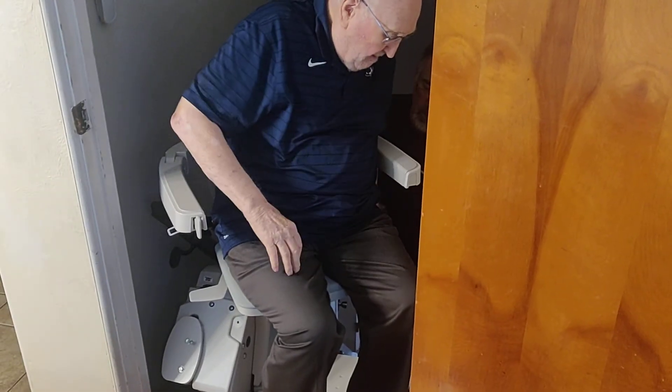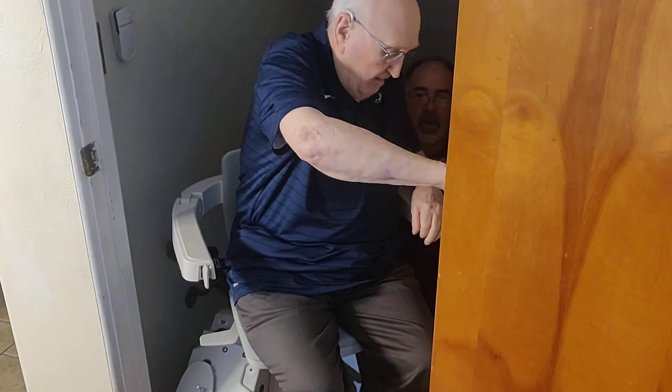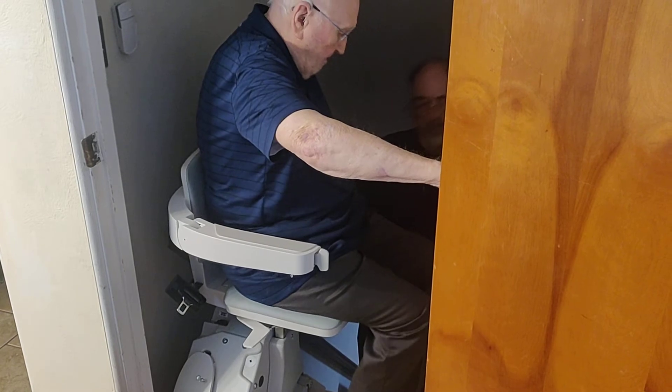Okay, now stop. You can hold this — don't have to hold this. Just push on here. You've got to turn. There you go. Perfect. Keep on going. That's it.